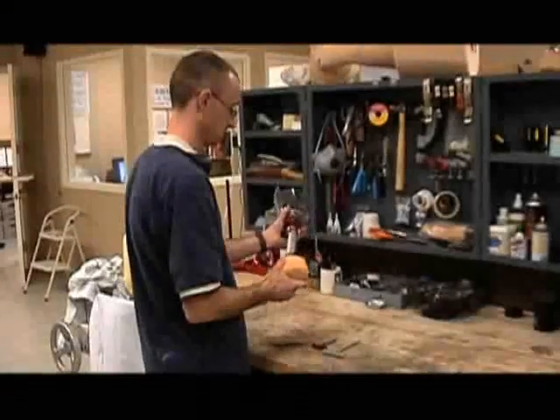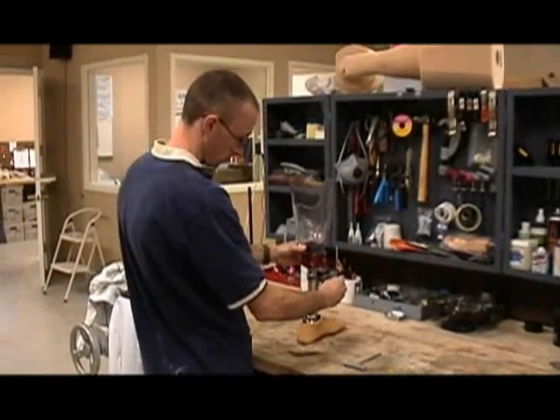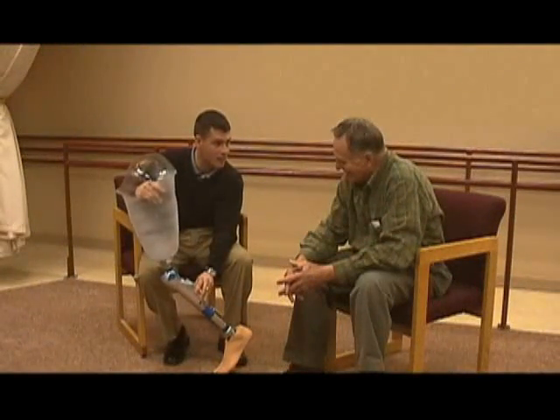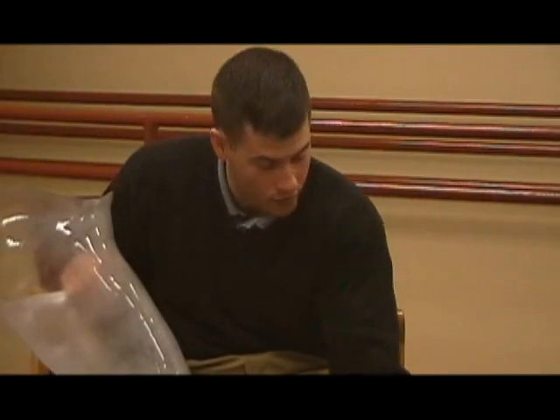It's about a 40-minute window between the end of the scan and the beginning of the test fitting. We use this time to get to know the patient, working with the patient and their family, developing a plan for their limb and a plan for their rehab. That's just the beginning — the beginning of learning how to operate within a new system. It's not just the prosthesis that we're providing; those are all equally important pieces in the puzzle.